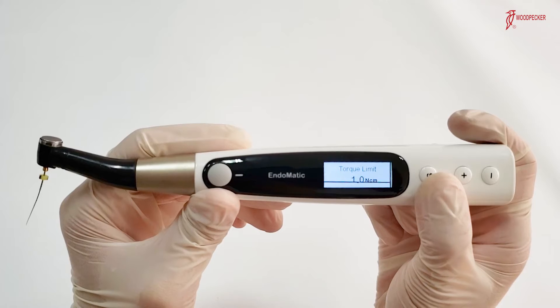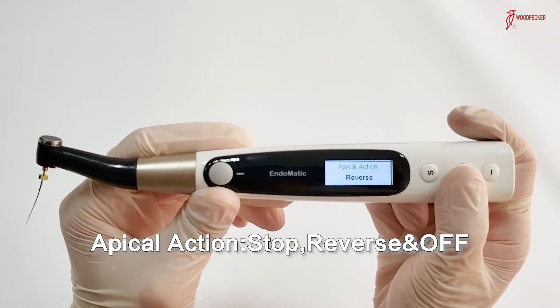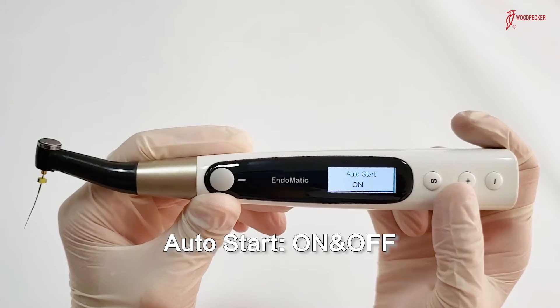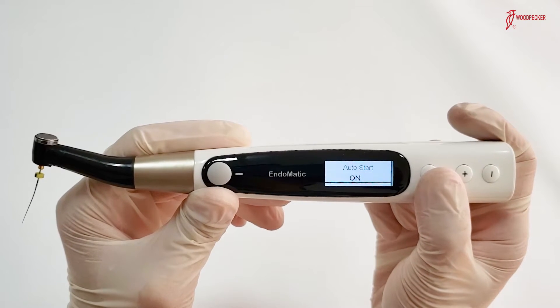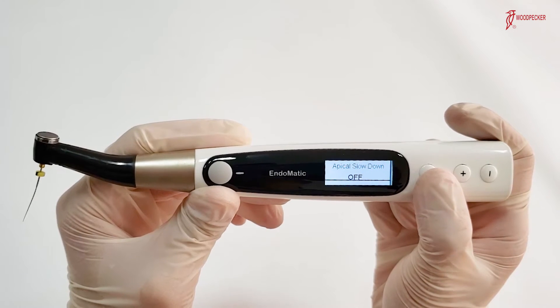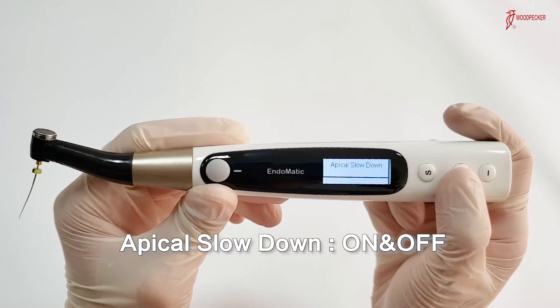Next mode is apical action mode, including stop, reverse, and off. Then next is auto start mode, including on and off. Next is flash bar position, to change the apical point. And apical slowdown, including on and off modes.